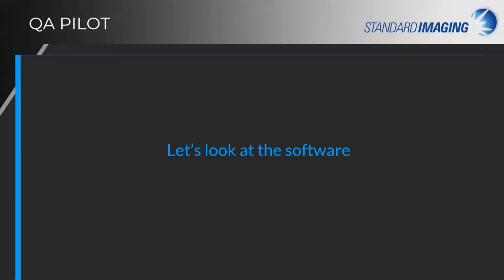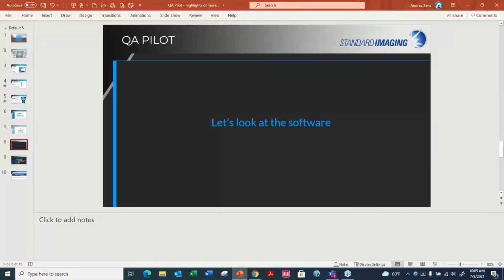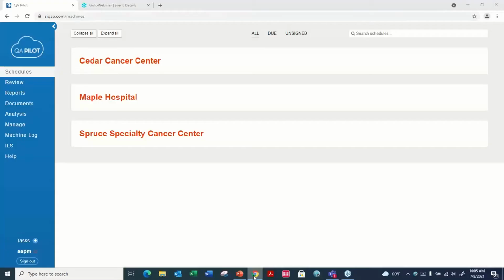So let's go ahead and look at the software, as that's what we're here for. Let me see if I'm sharing the right thing with you, as I'm not 100% sure that I am. Somebody wants to put a mention in the chat about whether I'm sharing the correct screen?